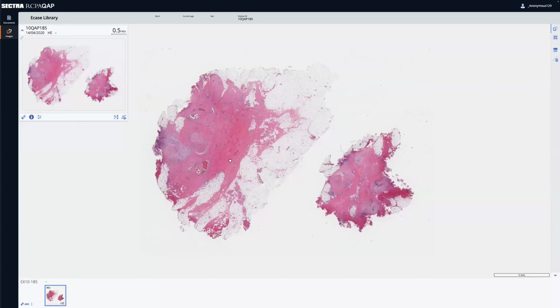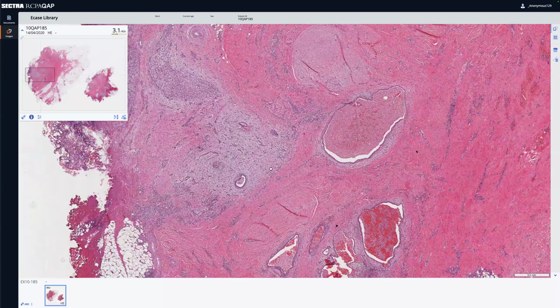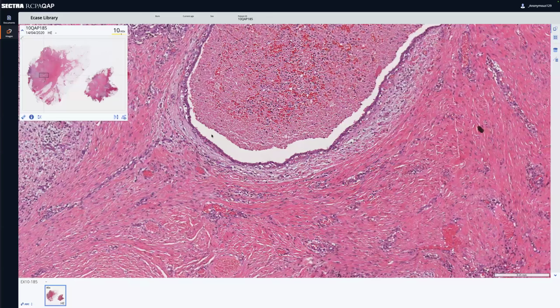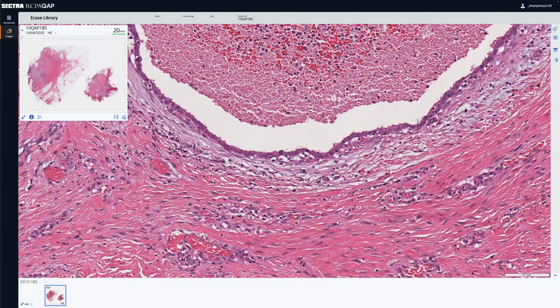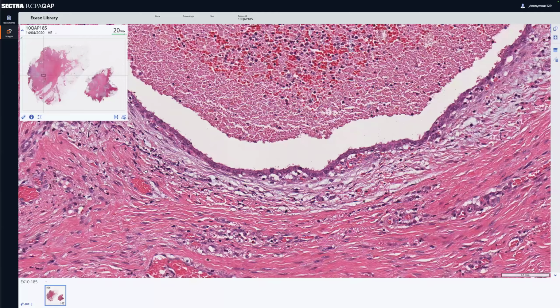This is not subtle. So to diagnose endometriosis, it's the 2 out of 3 rule. You need endometrial type epithelium, endometrial type stroma, and blood, 2 out of 3. Look here, these have got cilia on them. Well, that's weird because they're endometrial cells. What cells in the endometrium have cilia? Yeah, the surface epithelial cells. Well done. So it's okay to find cilia in endometriosis.